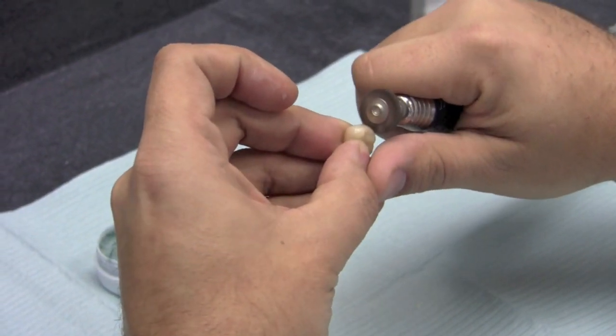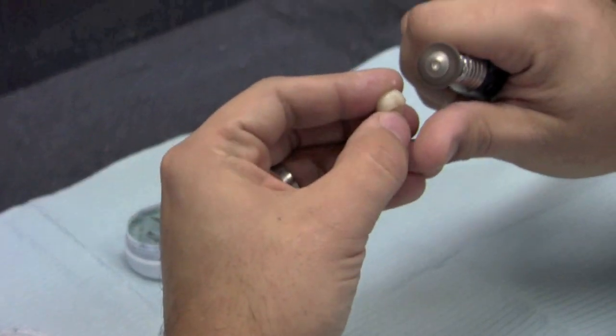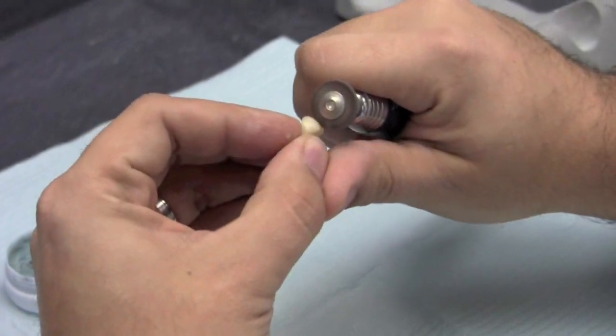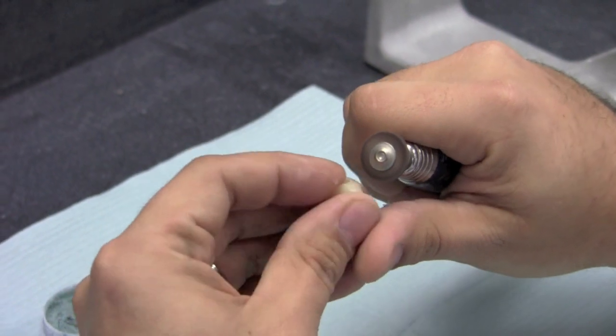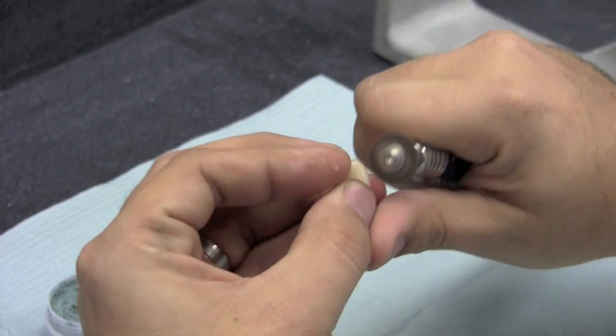You'll just want to go over the whole surface. If you run out of polish just go ahead and grab some more. It doesn't take very much to achieve a really nice surface polish.